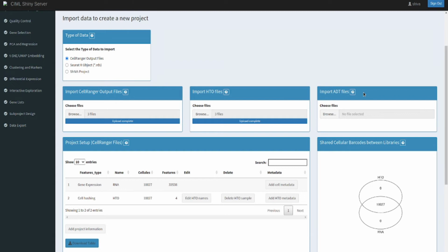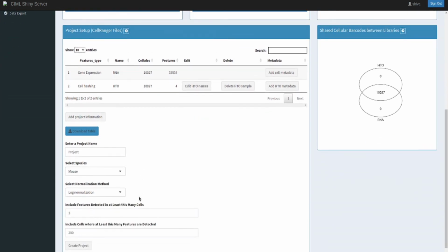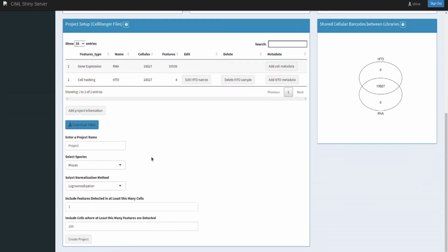Once the data is loaded, we need to create the project. To do this, we will give the project a name. This name must be explicit so that it can be easily identified later on. As our data is follicular lymphoma data, we will call the project FL Tutorial. You must then choose the species associated with your data. The choice is limited but only serves to preload some useful files later.